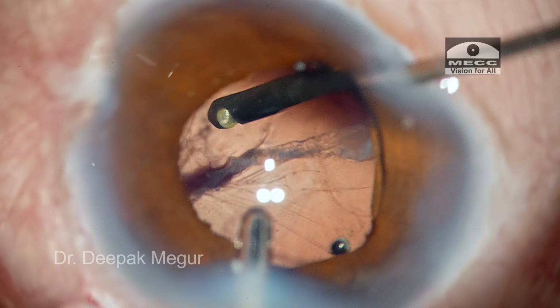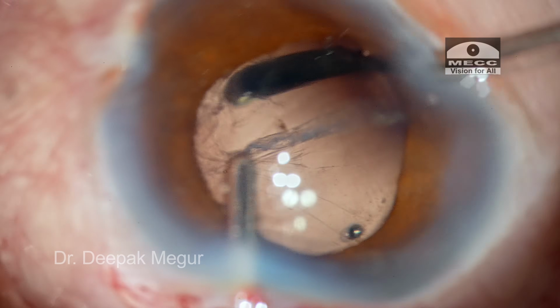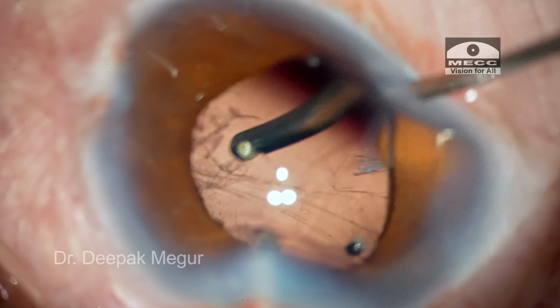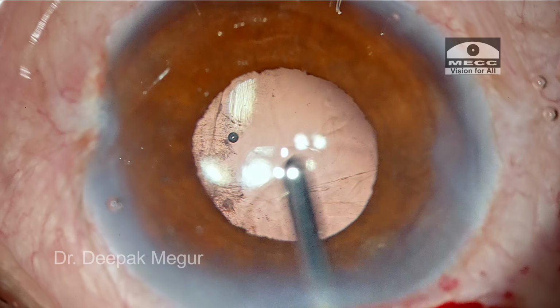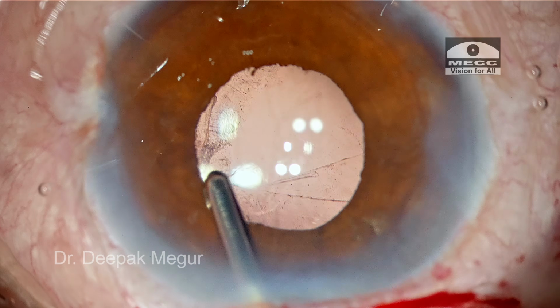So again, I go in through the side port incision, lift the lens up with the cutter and do the cleaning job. The blood clot, the OVD and some of the remaining vitreous is then cut and aspirated out. The visual axis seems to be very clear. I'm tapping on the lens to just ensure that the lens is very stable.